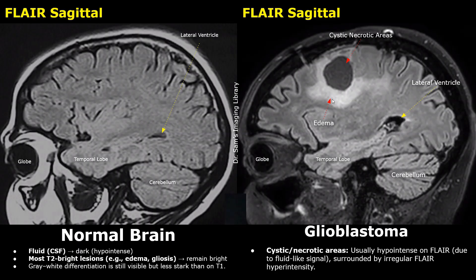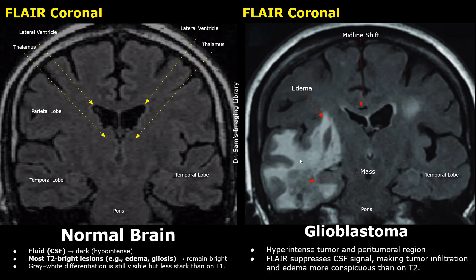Here we have a different case of a glioblastoma in the coronal plane. This is the mass — it is hyper-intense and heterogeneous, and it is surrounded by hyper-intense and somewhat homogeneous edema. Mass effect is noted; it has caused ventricular compression and a mild midline shift.